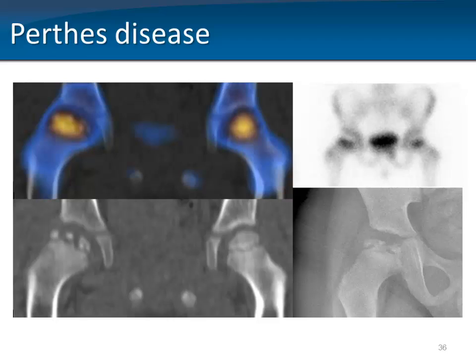Recently, we've also started doing SPECT-CT later in the disease course to see if it can add information on treatment decisions, in particular in those patients who have developed or followed the B pathway. But again, a little bit too early to say if we become any wiser out of it.